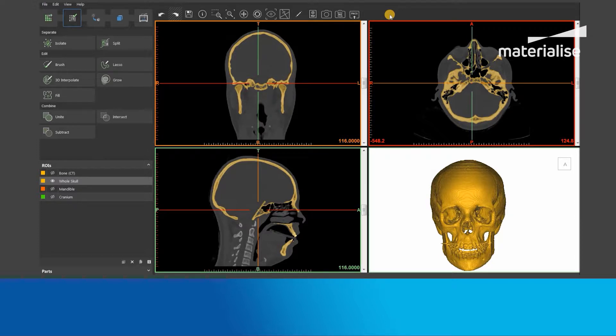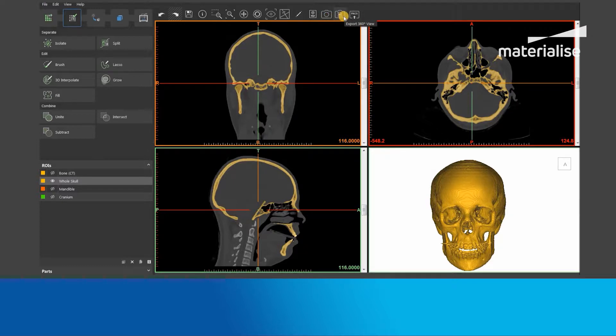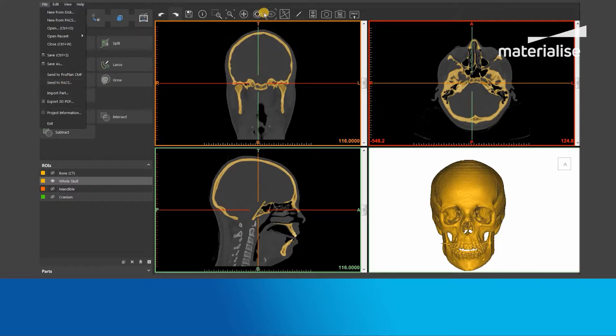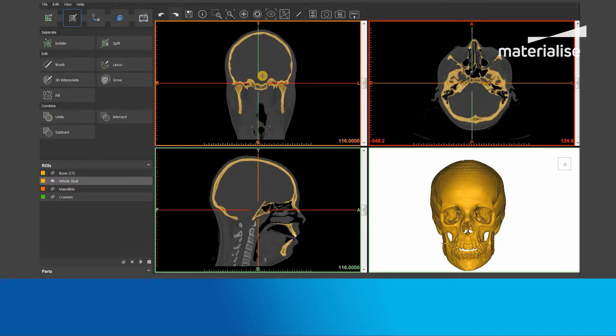The three tools are: Export 3D View, Export 360 Degree View, and Send to PACS. For this tutorial, we will use a skull dataset which would potentially be used to plan an orthognathic case.